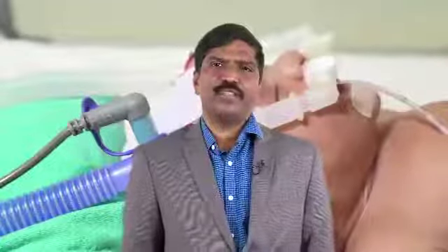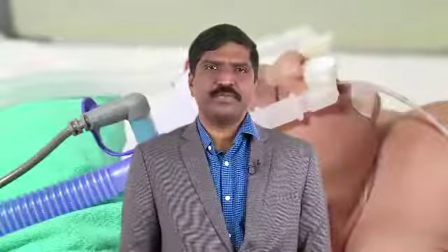CPAP machine is an essential component of all level 2 and level 3 NICUs. In this webcast, we will learn the components and types of CPAP machines. Cleaning, disinfection and troubleshooting with the use of CPAP machine will also be discussed.